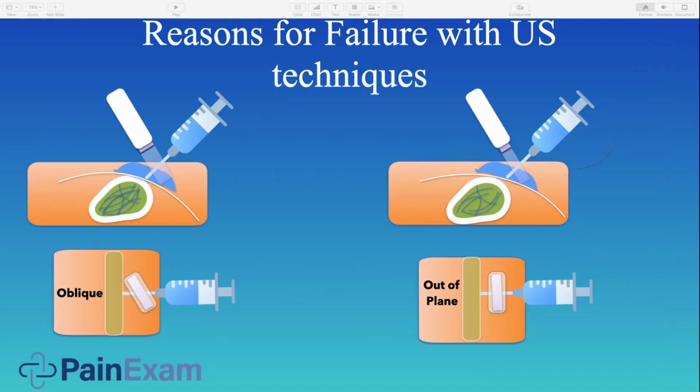So other reasons for failure: if your probe is oblique, you may not be seeing your needle tip, and you may think you're seeing your needle tip. As you see here, the image on the left, you're out of plane, but you may think you're in plane because you may actually see a line here on the ultrasound screen. Whereas if you know you're out of plane, you may just see a dot representing the needle tip, but you may not know where along the shaft or the tip that dot is.